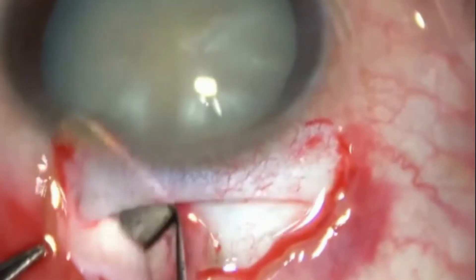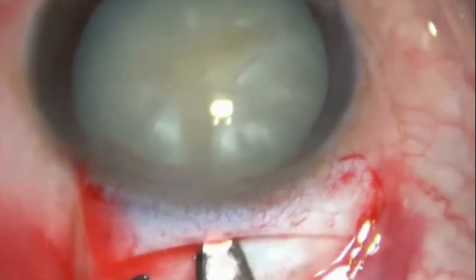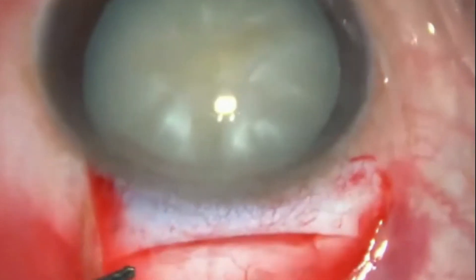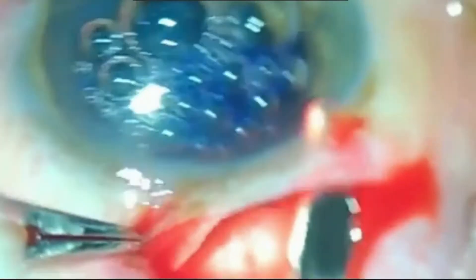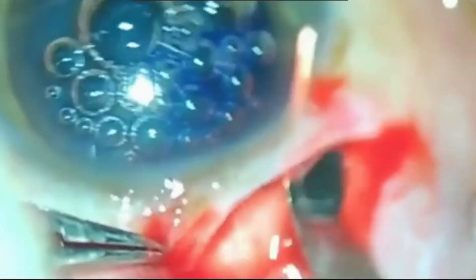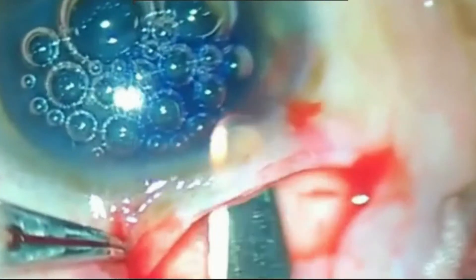If the crescent knife can be seen very clearly, this indicates that the scleral layer is very thin and the crescent knife might perforate to the outside, causing what is known as a buttonhole. A buttonhole can be corrected by making a deeper frown incision and dissecting the tunnel in a deeper plane, starting at the opposite side of the buttonhole. A crescent blade with bevel facing up may be useful in this situation.